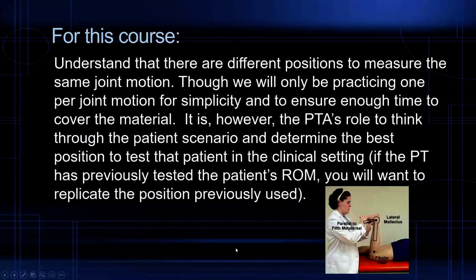So I want you guys to know too that, like I said, there are different positions to measure the same joint motion in. We're only going to be practicing one per joint for simplicity, and again for reliability and validity. And it is your job though as a PTA to think through the patient's scenario and determine the best position to test them in once you get into the clinic.